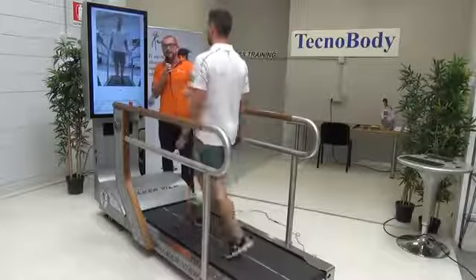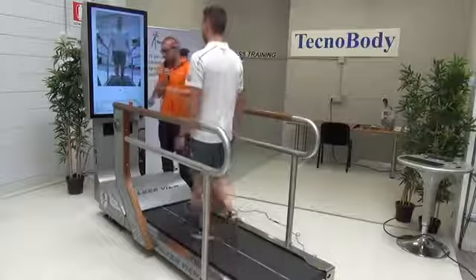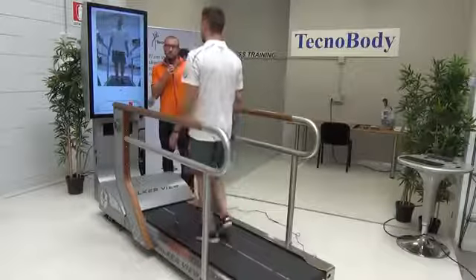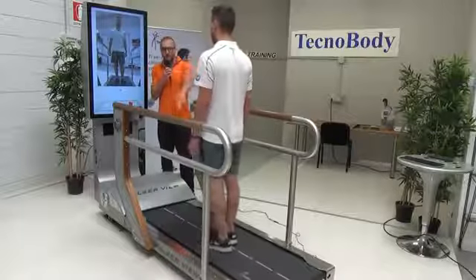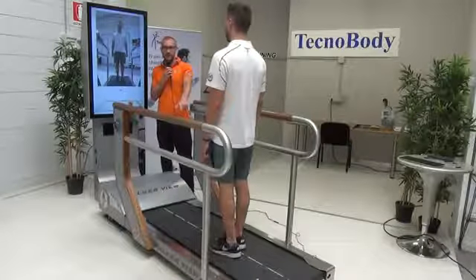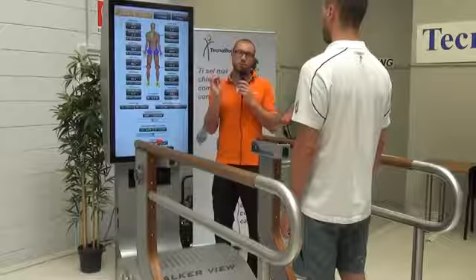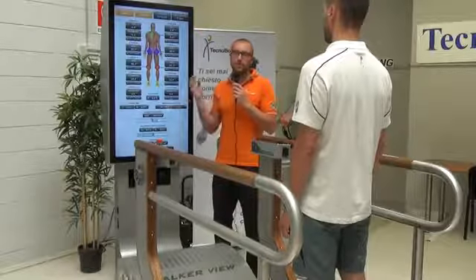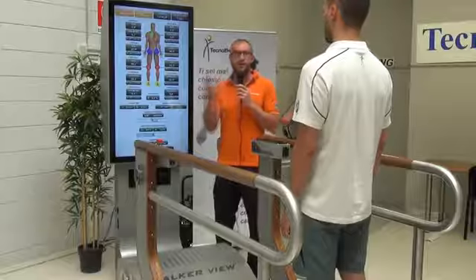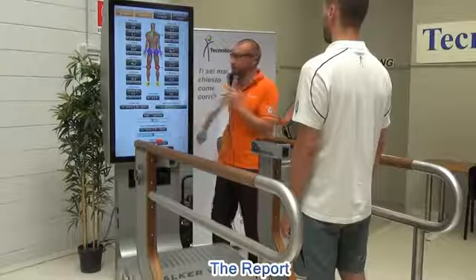At the end of the gait analysis, there will be a final report that, through the integration of the load cells information and the camera information about the range of motion of all the body, will provide all this report plus the new information provided by the two sensors about the feet movement. At the end of the gait analysis test, the software straight away is going to show very quickly the final report. It's very important because this report is generated very quickly, so the therapist or the trainer can give some feedback in real time or after an elaboration.